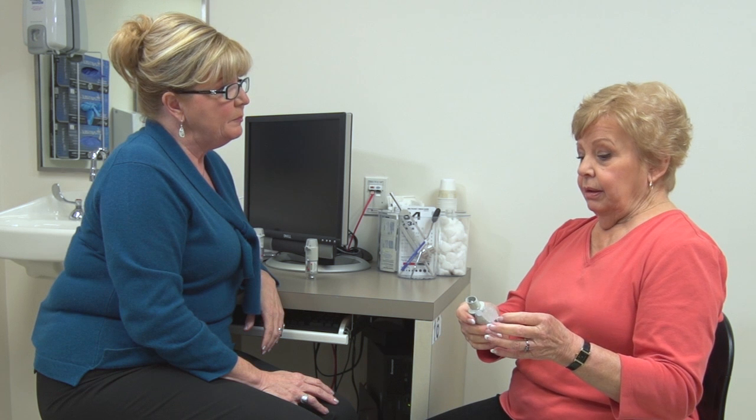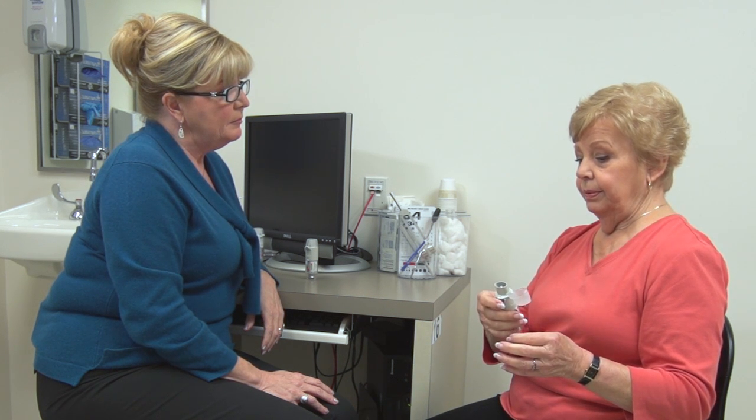The patient demonstrates priming the device correctly. It's very important to provide feedback to the patient so that she learns to use the device correctly. Notice that Mary does not tell Mrs. Ryan the next steps — instead, she waits patiently while Mrs. Ryan recalls each step and provides feedback throughout the process. Mrs. Ryan then twists to load the dose, opens the cap, exhales, inhales the medication slowly and deeply, and holds her breath. Mary affirms: 'Good job.'